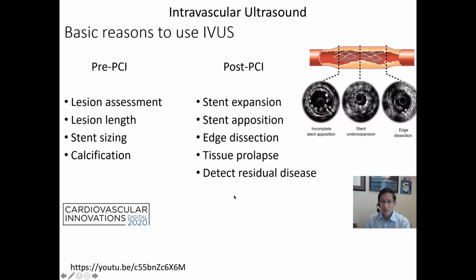And how you make the decision whether or not you're going to put one of these in to check is something that I can't tell you. There's probably a checklist like, oh, we had to inflate to this pressure. That is a risk, right? Let's go in and make sure everything's good. If the pressure was really high, right, et cetera, et cetera. So, okay, that's it. And so those are the ultrasound applications.